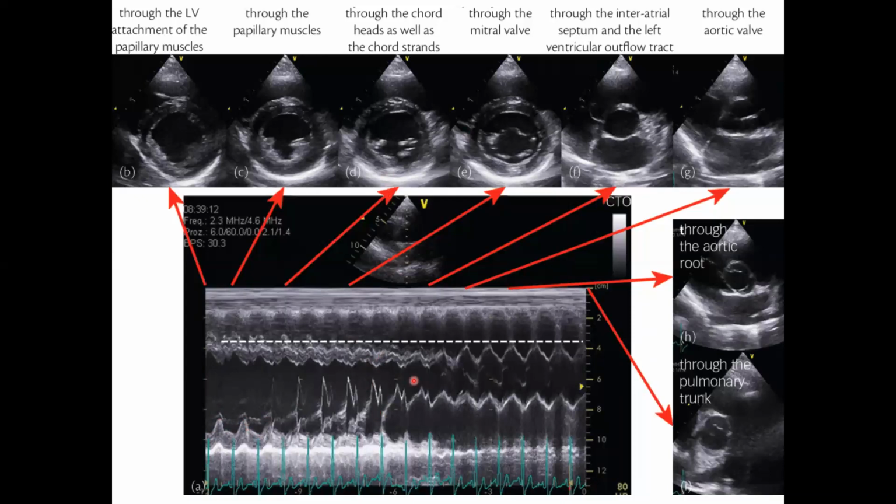So that's kind of cool. This dashed line here represents pretty well this line across here, to position yourself up and down on that. Okay, any questions about that? That's called M mode imaging.